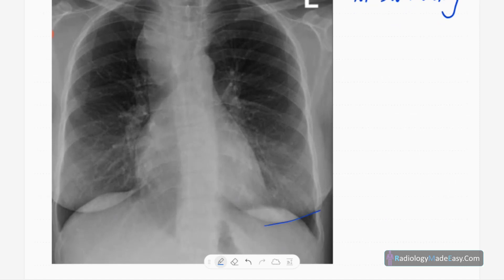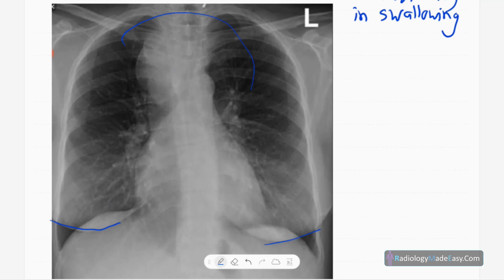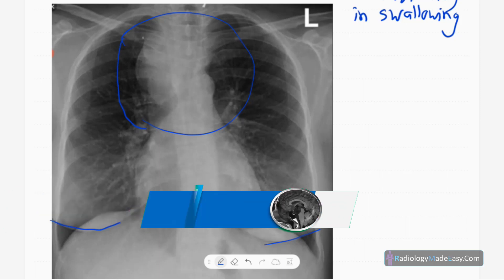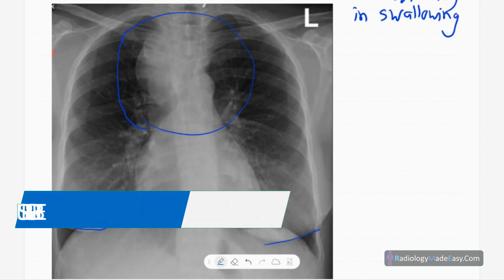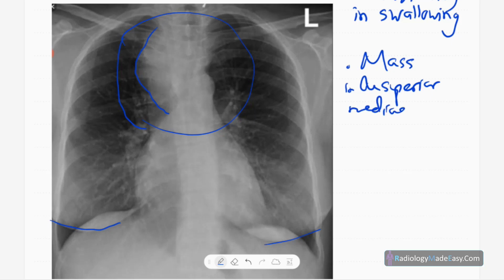You can see the abnormality — there is superior mediastinal widening due to a mass. The mass is mainly located in the right paratracheal region. It has a well-defined lateral margin, while the medial margins merge with the superior mediastinum. The mass has soft tissue density and there are no air bronchograms, air-fluid levels, calcifications, or cavitations.